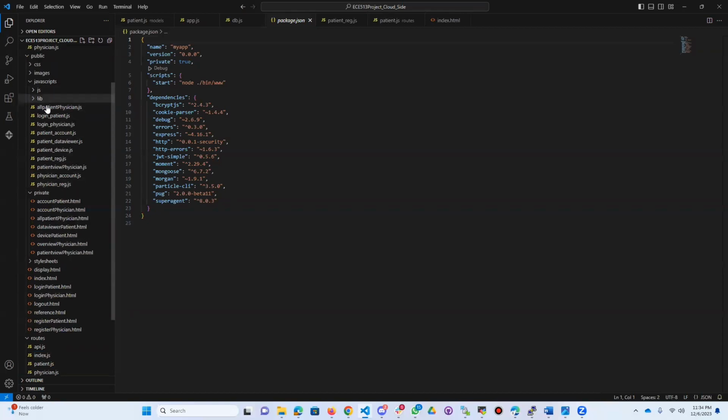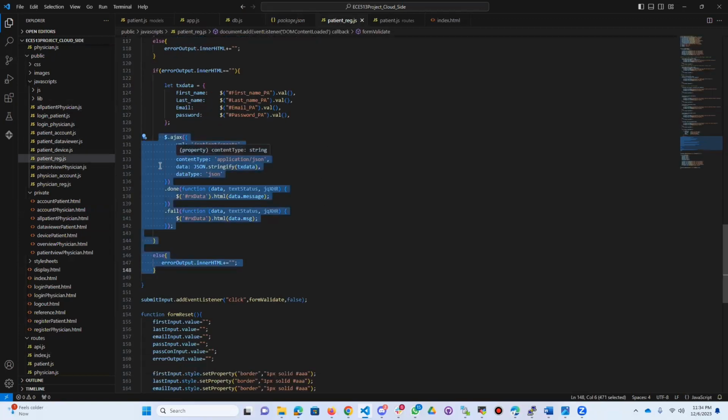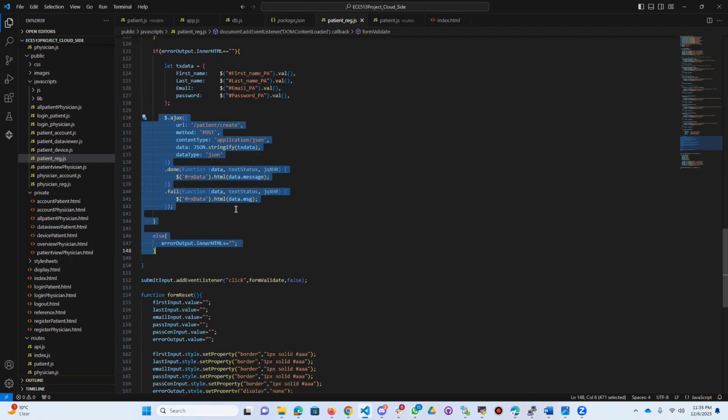And if we move to the JS in the public folder, the patient track file, I guess I put it here. Here you can see Ajax, and the JS is using the jQuery Ajax function to make a POST request to the patient/create endpoint on the server. It sends data serialized as JSON in the request body. Upon a successful response, the content of the element with the ID RX data is updated with the message received from the server. In case of failure, it updates the same element with an error message. Additionally, it contains a conditional statement checking if the error output element exists, in which case it resets its content to an empty string.